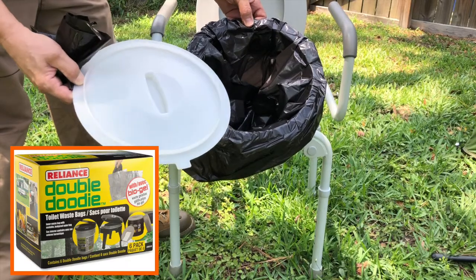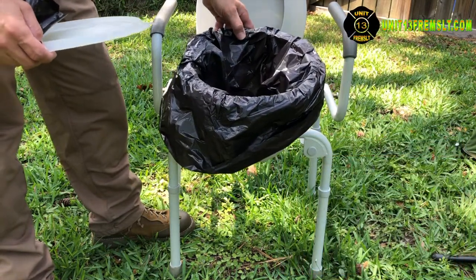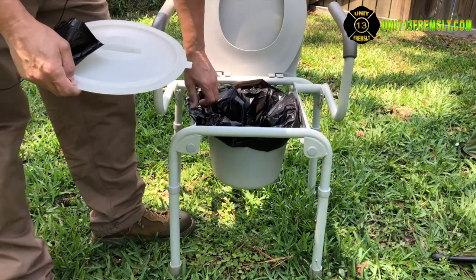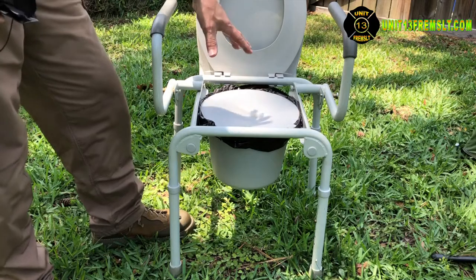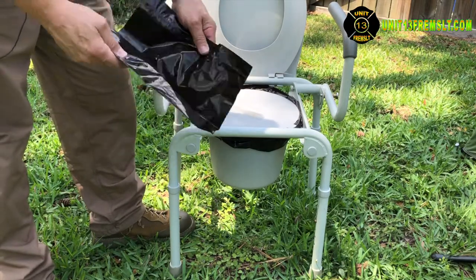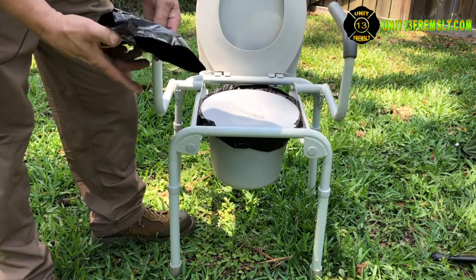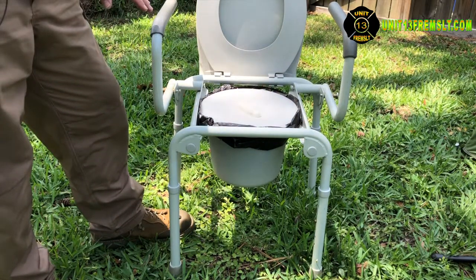You can use those toilet bags where you put a powder down inside that gels up all the liquids and helps take away odor from the solids. Those bags are designed to be used multiple times. There's a lid that can be closed down on top to keep flies away and keep the smell out of camp. Once you're done with that bag, you drop it inside a ziplock bag and then supposedly you can drop it straight into a trash can and it goes to the landfill.